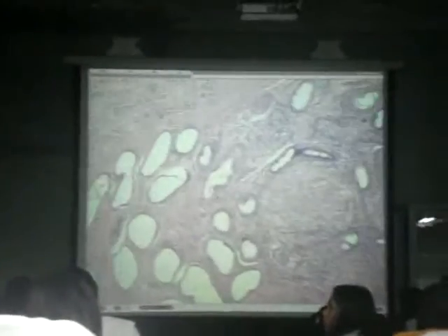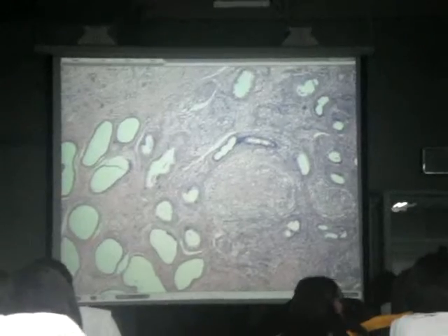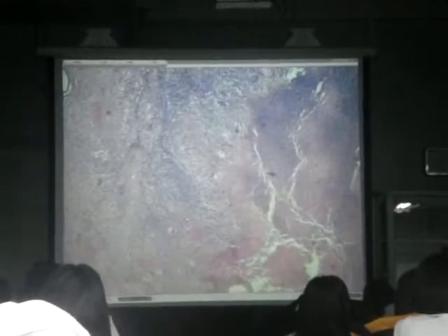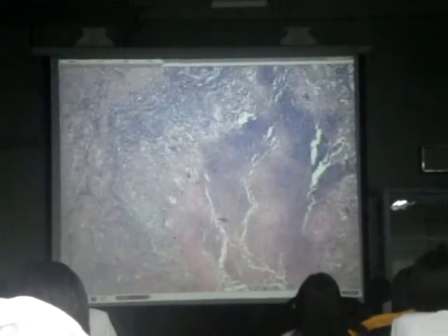Okay. Moving it on the side, we know where we are, right? We identified that. Let's move it. Let's move the slide.